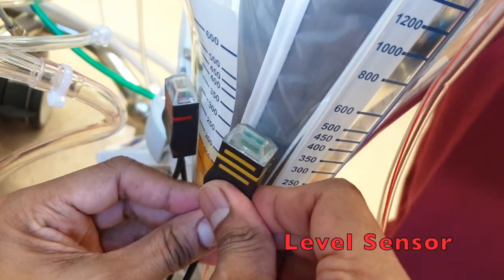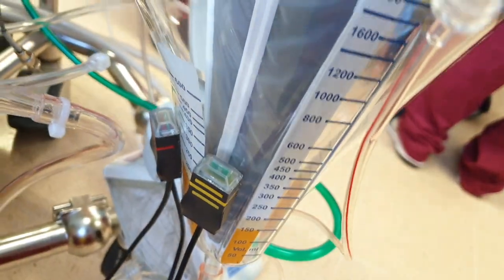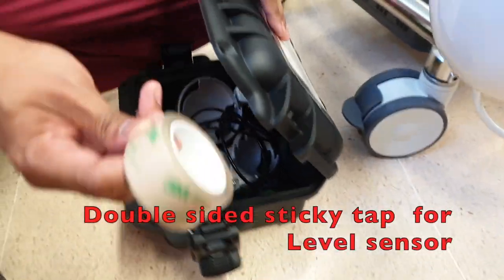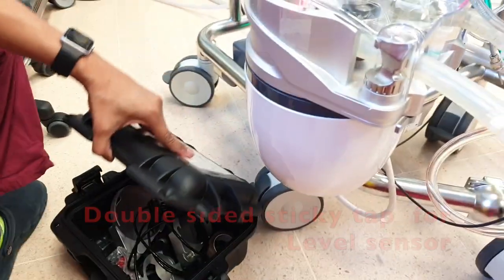So it just sticks automatically. If you need to change it, there's a sticky tape for that. You can use just a double sided tape. Okay. So, yeah. Arterial temperature.